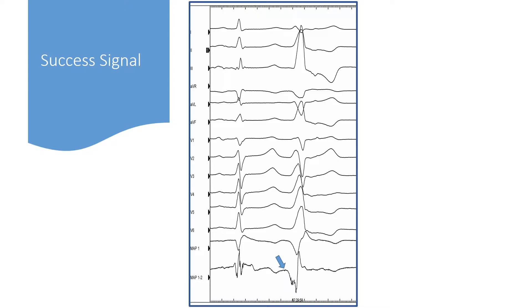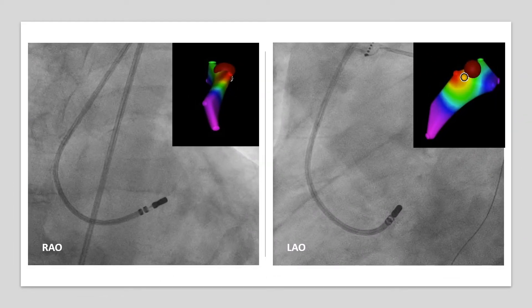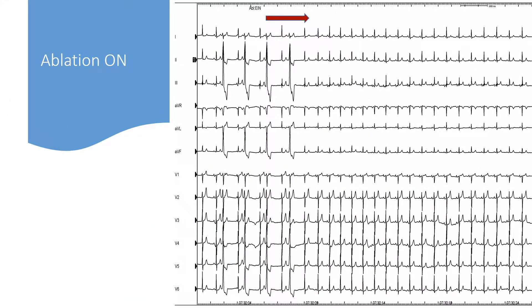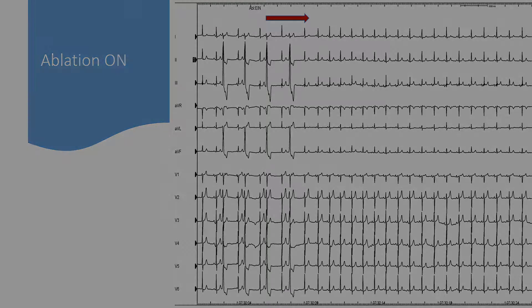Here we find this signal at the successful ablation site, which was almost 40 milliseconds earlier than the beginning of the QRS complex. This figure shows RAO and LAO projections in fluoroscopy images and targeted 3D mapping in the left coronary cusp. We saw the successful ablation signal with a small cusp potential, and here is the ablation effect. It's very important to have and search for this cusp potential during ablation of the PVC in the cusp.